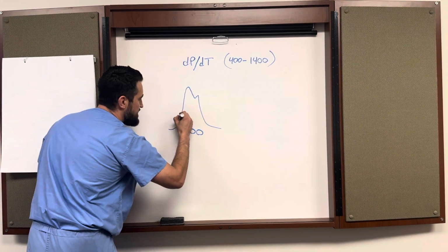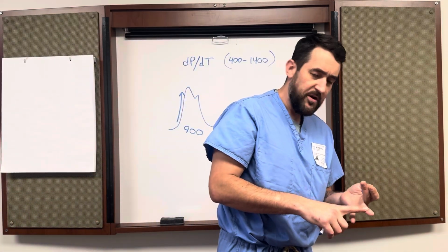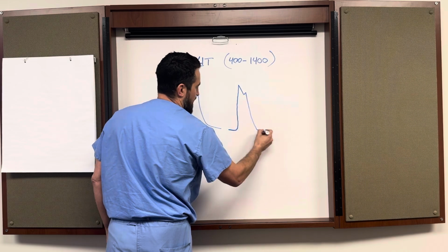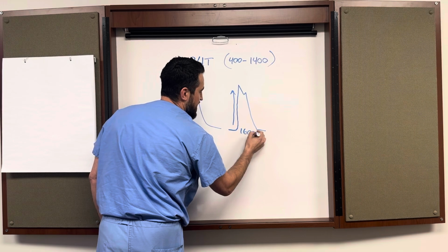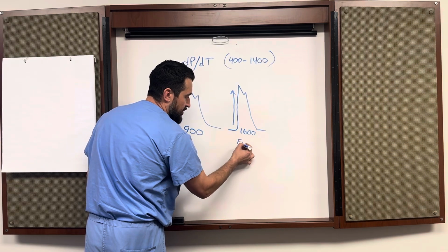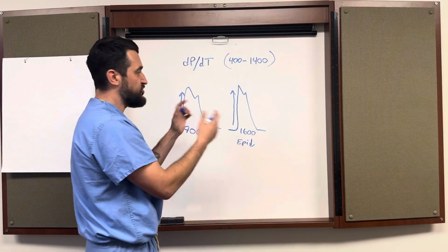Remember, what we're looking at is this angle here. Well, after we warm the patient up and we resuscitate their volume status and things like that, let's say 4 hours later, this patient has really improved, and this angle is now steeper. We'll make it 1600. Well, if this person was still on a little bit of epi, it could be an indicator that we could start weaning the epi. So it's an idea of how strong the heart is contracting, right?